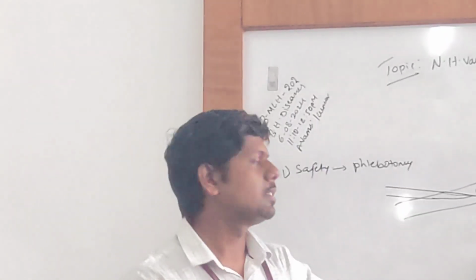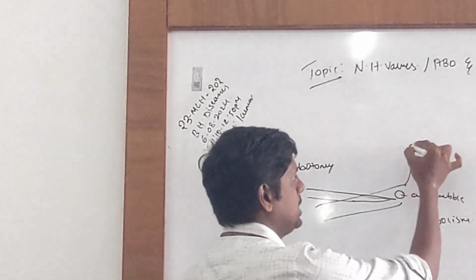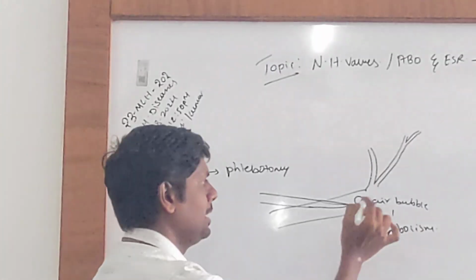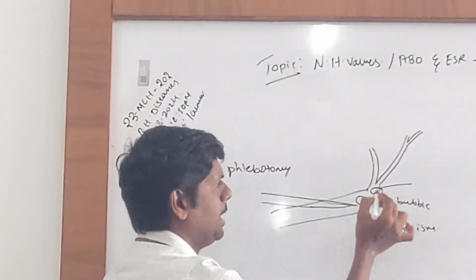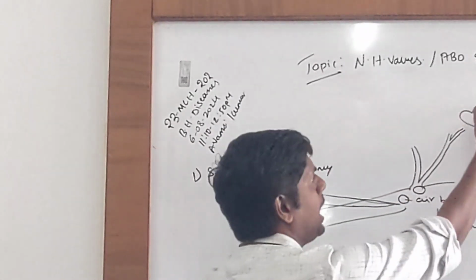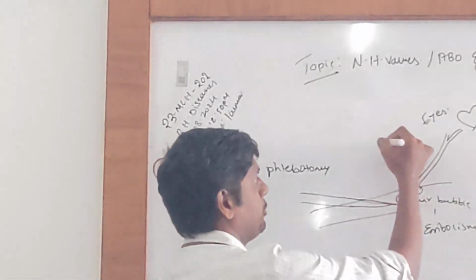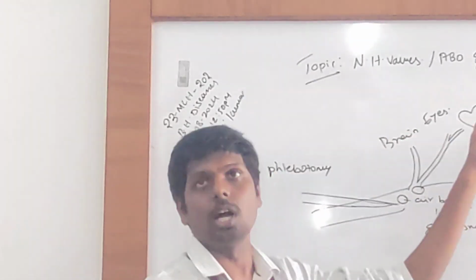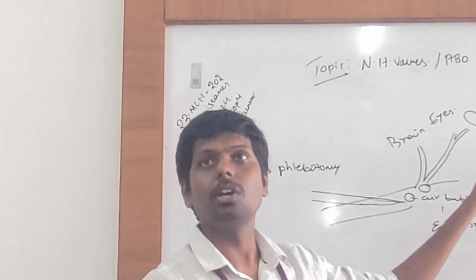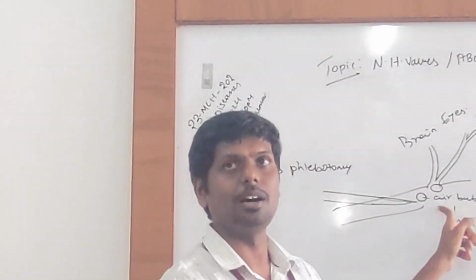Now this embolus will initiate blood clotting. So for example, the same blood vessel became very narrow, very thin here. Now just imagine this air bubble blocked this blood supply. And imagine if this is the blood going to the heart or to the eyes. Imagine this is going to the brain, and now your brain is not getting blood supply. What happens? Immediate death. Okay. So you have to be very cautious when you are drawing blood from the blood vessel.